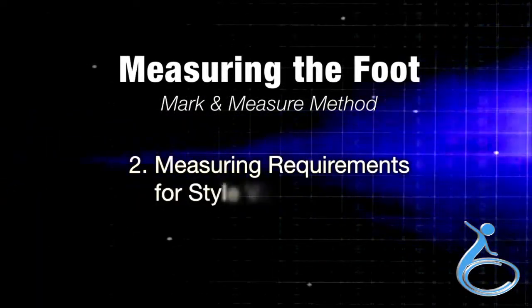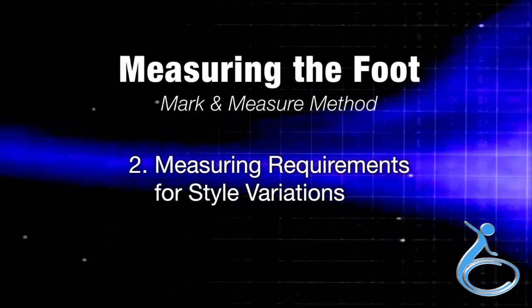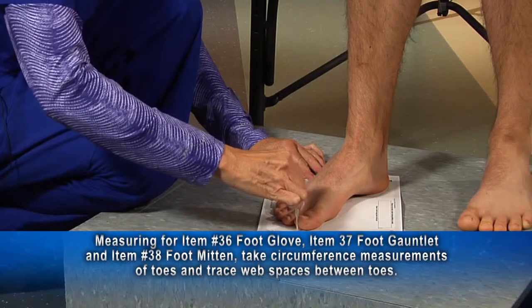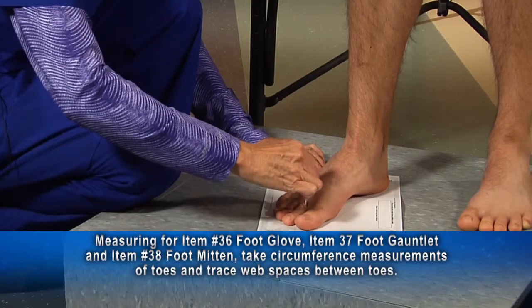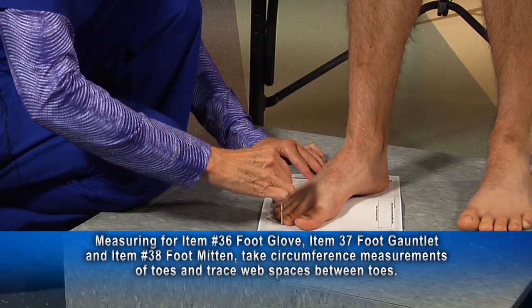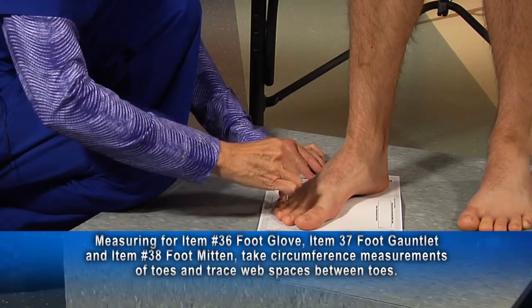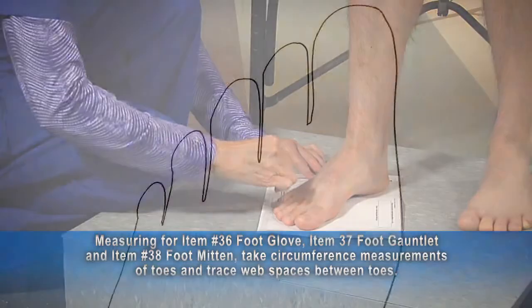Section 2 of the video covers measuring requirements for style variations. When measuring for a foot glove, foot gauntlet, or foot mitten, specialty items required for the separation of toes, a tracing of the foot and toe circumferences would be required. Use the foot tracing guide.